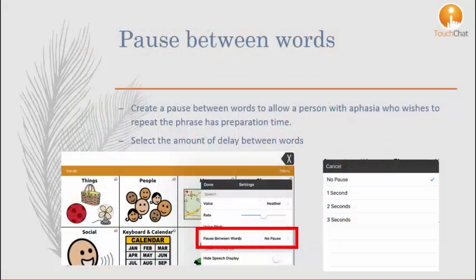Another useful setting is to add a pause between words. This allows a person with aphasia who wishes to repeat the phrase more preparation time.